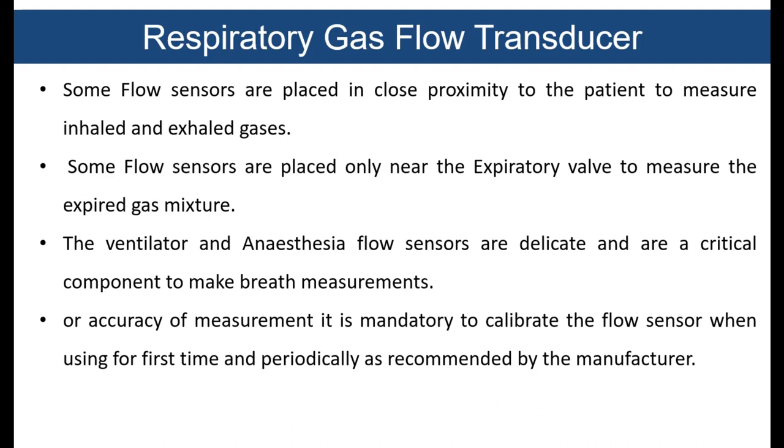Some flow sensors are placed in close proximity to the patient to measure inhaled and exhaled gases. Some flow sensors are placed nearby the expiratory valve to measure the expired gas mixture. The ventilator and anesthesia flow sensors are delicate and are a critical component for making breath measurements. For accuracy of measurement, it is mandatory to calibrate the flow sensor when using it for the first time and periodically as recommended by the manufacturer.